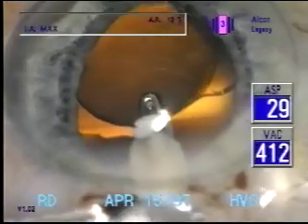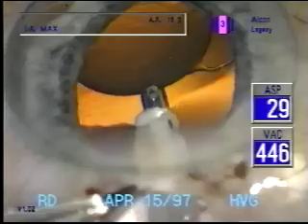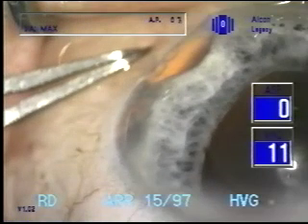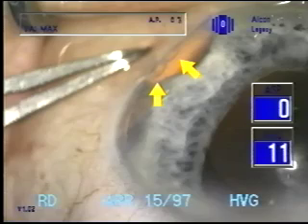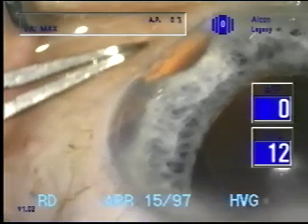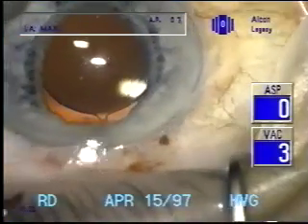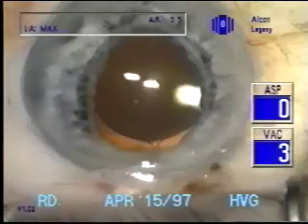As the viscoelastic is removed and the capsular bag flattens, the circumference is increased and now the ends of the endocapsular tension ring are separated and just touching. This is clinical evidence that the capsule without the cataract in it has a larger diameter than when the cataract is in place.